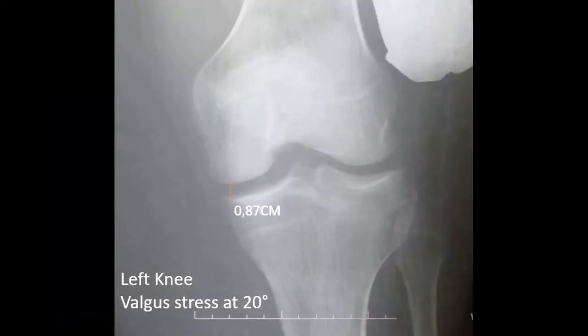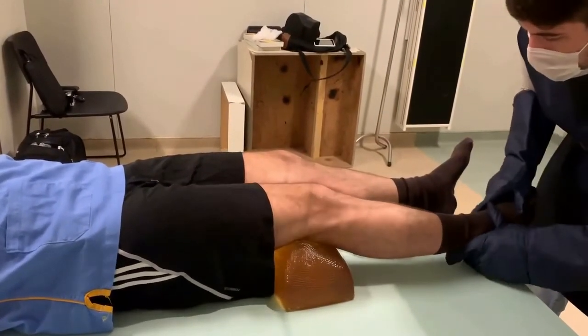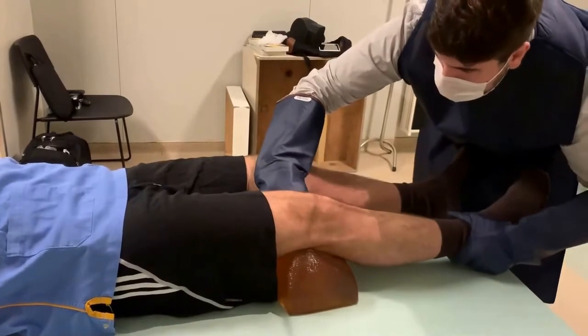The X-ray shows 0.85 cm of medial opening. We perform the same steps on the contralateral knee in order to compare the opening of the medial and lateral space and define the correct diagnosis of possible ligament injuries.